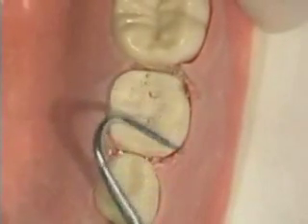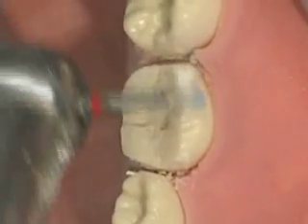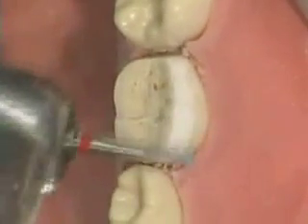Look at the preparation so far and you'll notice that it is occlusally square. You've squared off the distal and mesial proximal walls, and all these line angles are sharp. If you study the internal detail of the crown, everything is rounded — your preparation needs to reflect that roundness. So go back to the preparation and round or bevel all line angles.